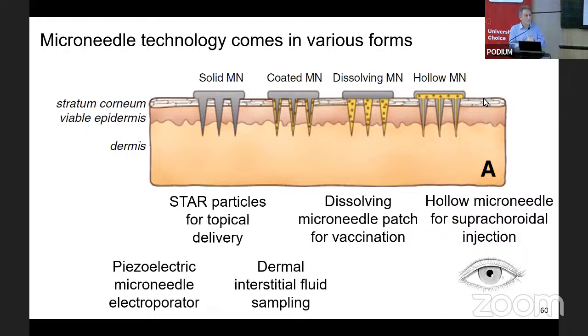Hopefully you have some better understanding about what microneedles are and all the various things they can do, whether we use them as a simple to administer patch for vaccination, can rub them on the skin for dermatologicals, we can turn them into electrodes for electroporation, we can use them in reverse to pull fluid out of the skin, and we can use them for targeted injections in the eye.